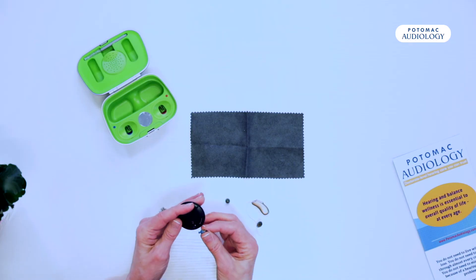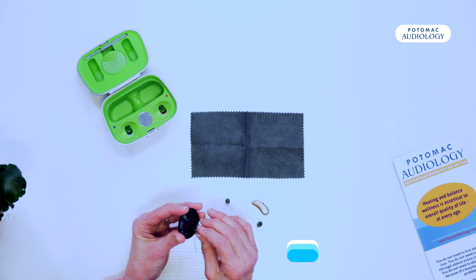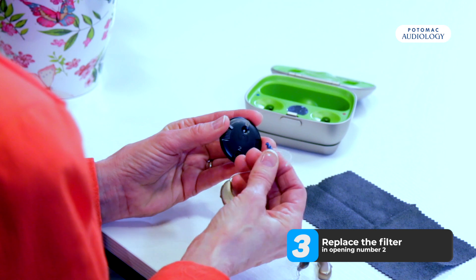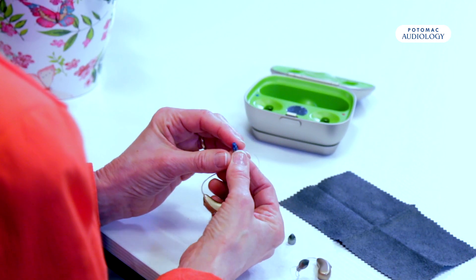Now we're going to go into the second opening where there's a new filter, push down, and you'll feel and hear a little click. Pull it out and you will see the new filter in the hearing aid.